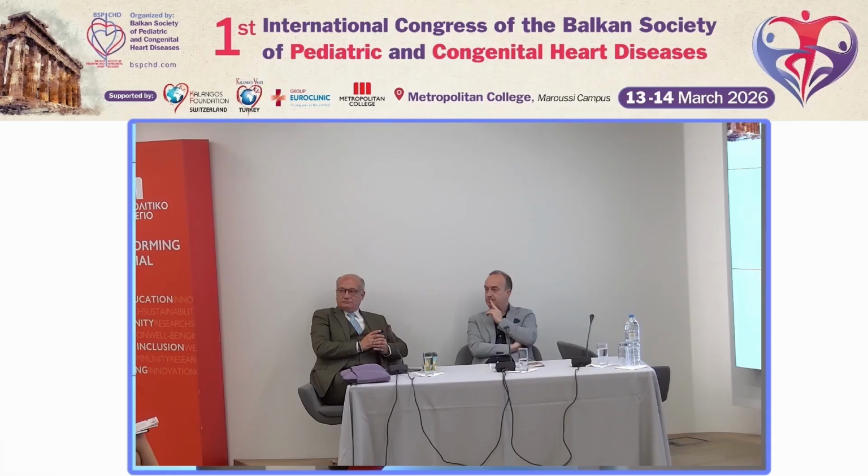The CT is getting better, and now a lot of places fuse the CT and 3D echo. I don't know, have you heard about the new Pioneer GE machine? You can put in a USB drive with the CT, and you can merge the CT and 3D echo.